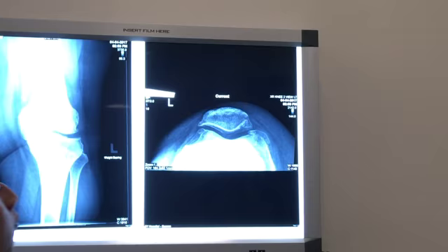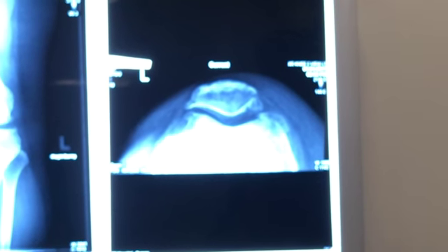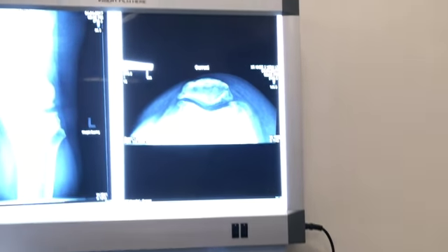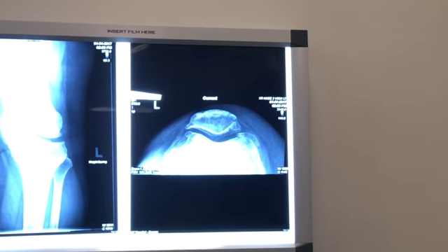For the sunrise, this one was the hardest of them all because I was going to do it on the table. Now the patient was hypersthenic, and I tried moving her on the table by myself, but that failed. So I had to ask another technologist to come in and help me, and we were able to get her on the table.